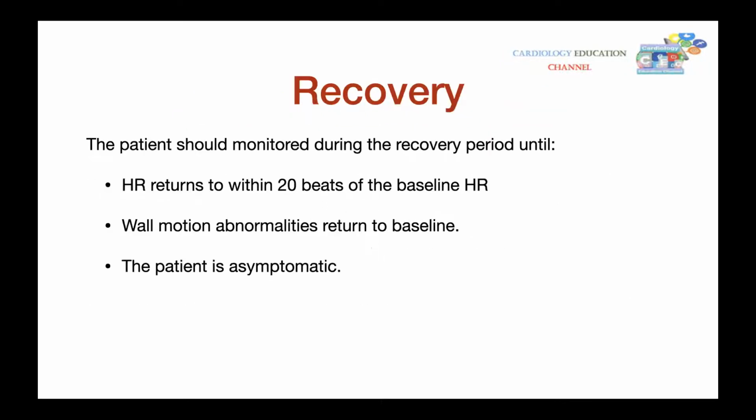So then recovery, and when you should image your recovery images. The patient should be monitored during the recovery until his heart rate returns within 20 beats of the baseline heart rate, the wall motion abnormalities return to what they had been at baseline, and the patient is asymptomatic without any symptoms.